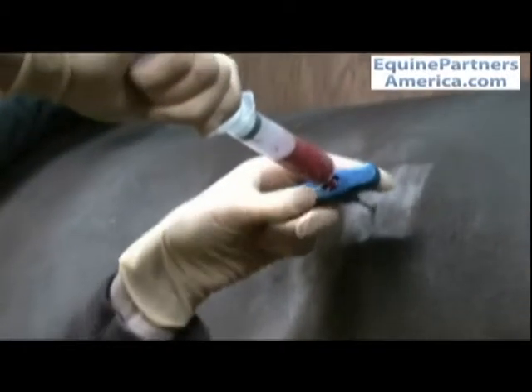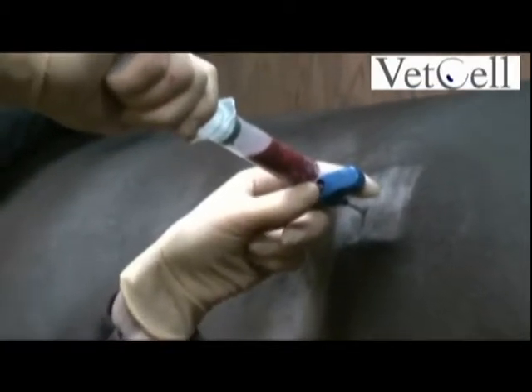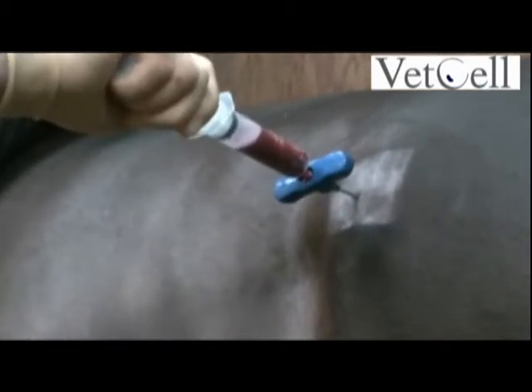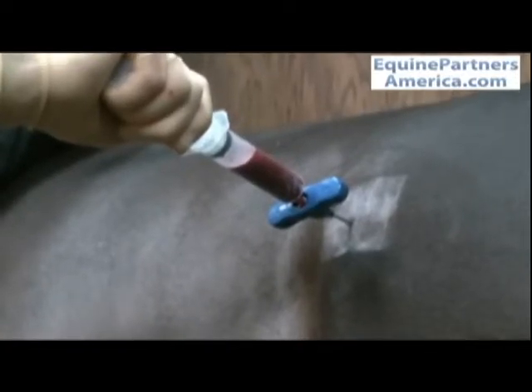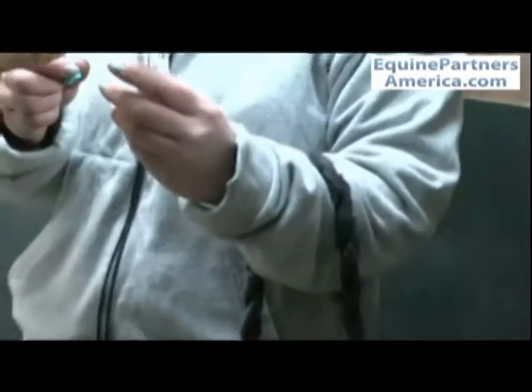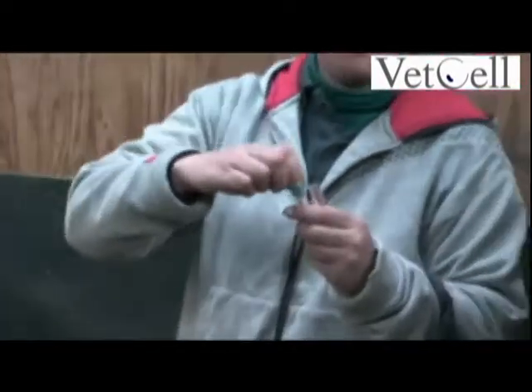Now this has got no anticoagulant in it, so we need to be fairly rapid about getting it into the citrate vials. Grab a couple of tubes. Getting a good collection here. These ones you have to shake vigorously as they clot quickly.